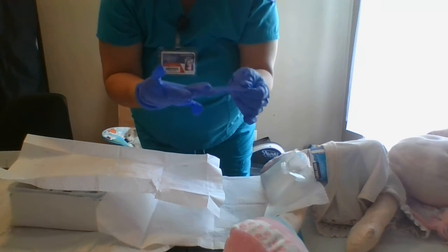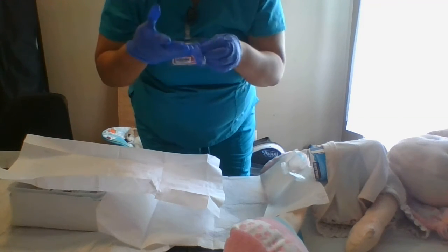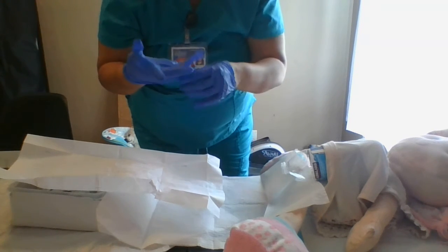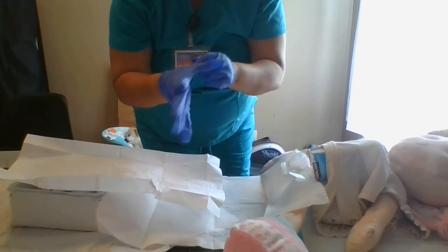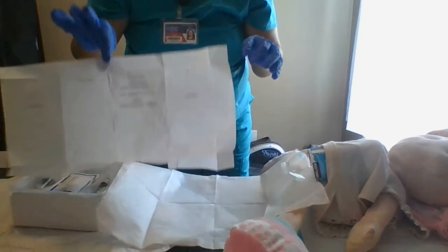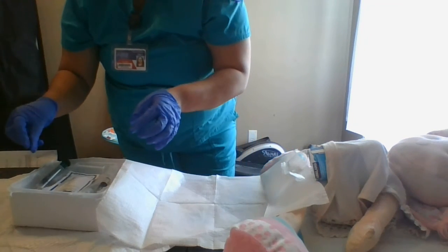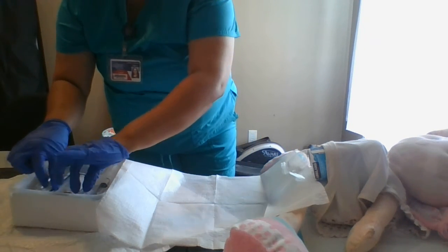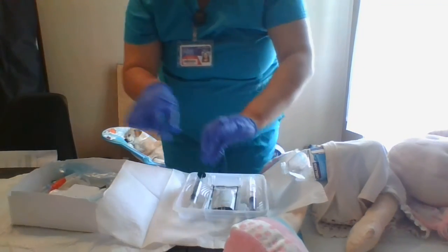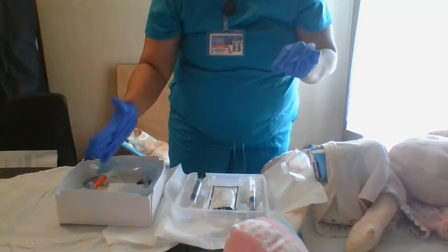Okay, now I can touch sterile to sterile so that I can adjust it. Okay, dispose of this in the trash. Now I'm touching my sterile inside of my kit with my sterile gloves. Touching the inside of this part, again, sterile to sterile.